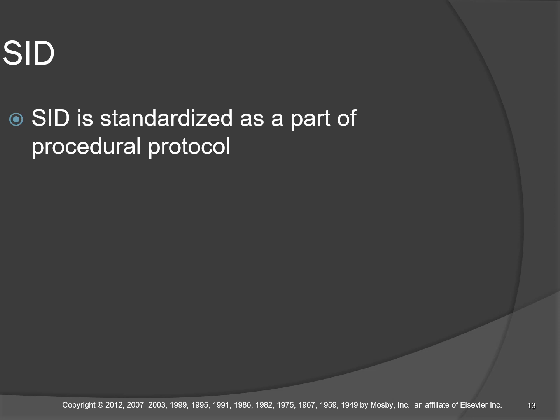and it will have the effect of magnifying the center of the X-ray and everything else is spreading out to the side. So even a patient that minimally opens their mouth, you can get a decent odontoid with a shortened SID. Okay. By and large, though, you have to understand the adverse effects that are going to happen when you start manipulating the SID.